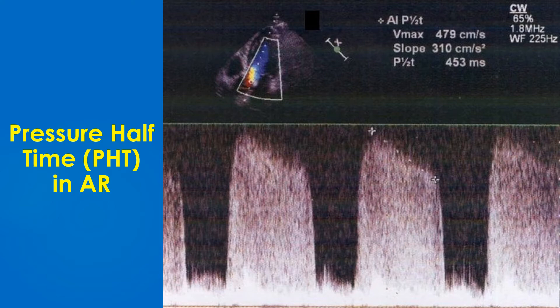The peak velocity or Vmax of the aortic regurgitation jet is shown as 479 cm per second. AR PHT is shown as 453 ms. The AR deceleration is shown as 310 cm per second squared.